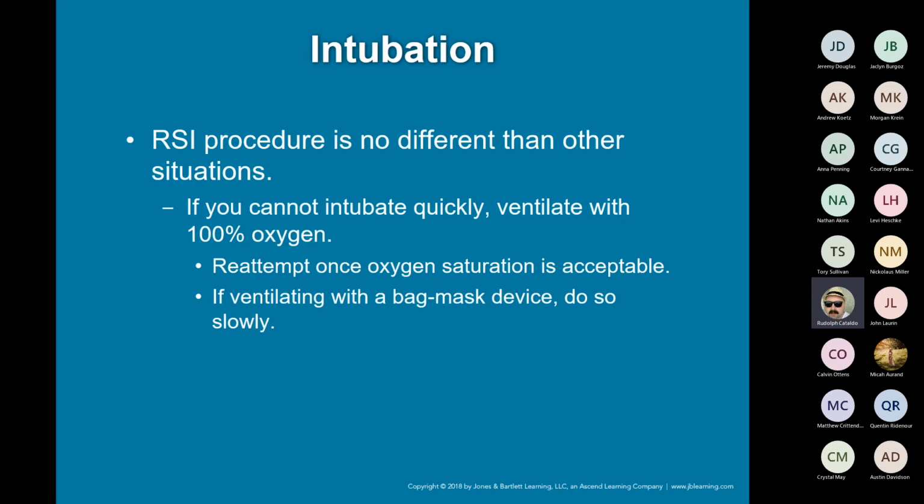Now, the intubation is probably the easiest part of RSI. I mean, the procedure of literally passing the tube through is not anything too terrifying. Something you'll also see is them maybe put a nasal cannula in the patient's nose, even though they're not breathing, they're trying to get them some oxygen before they perform the intubation.